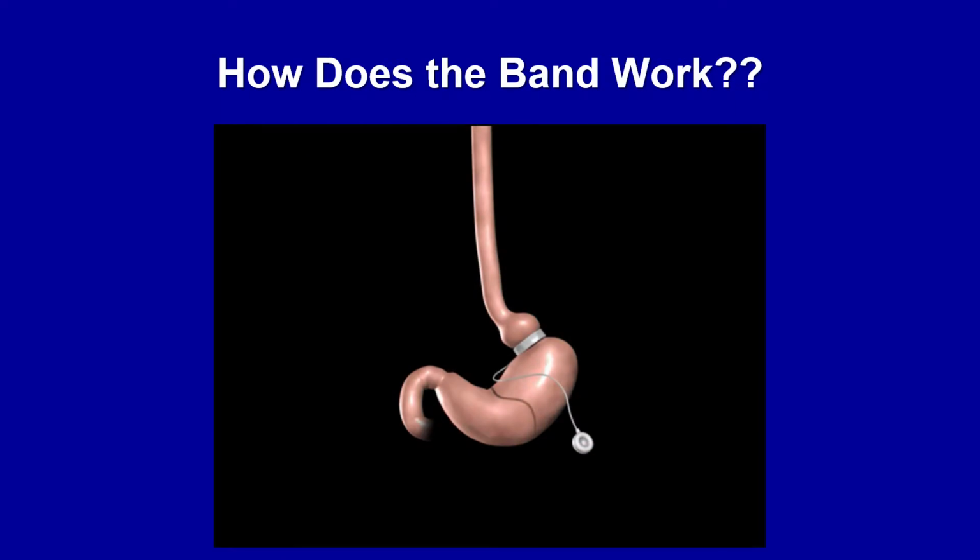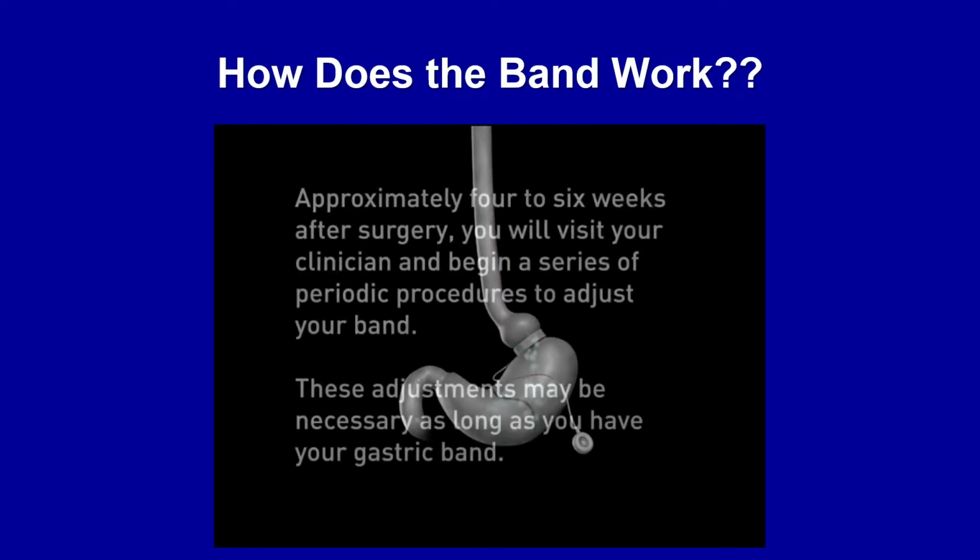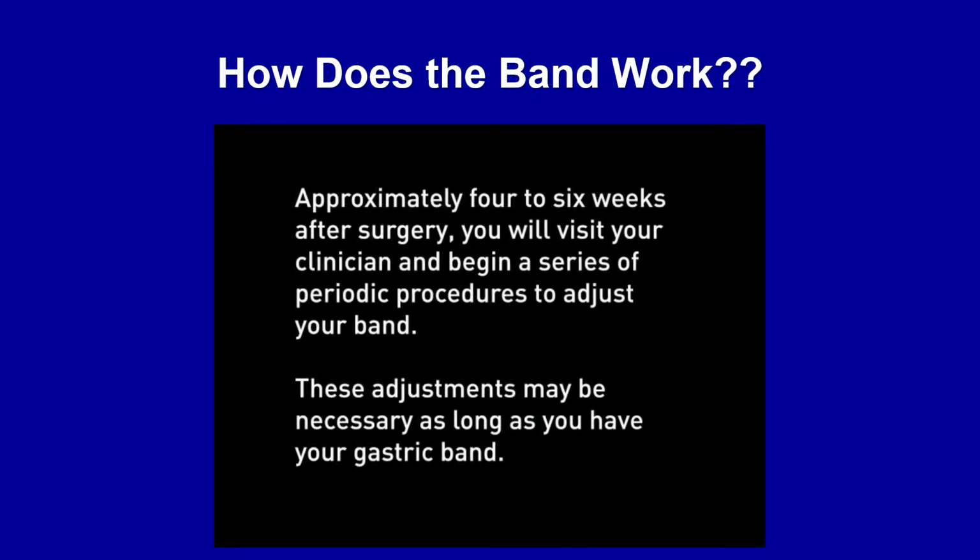So when you have a band in place that has not been tightened, it pinches a little bit on the top part of the stomach. So when food comes down into the stomach, you fill up that little stomach, and then it hits that little pinched part. And it takes a while for the food to make its way out through that little pinched part, kind of like food is moving out through the bottom of a kitchen funnel. But the neat thing about a band is that we can adjust it.